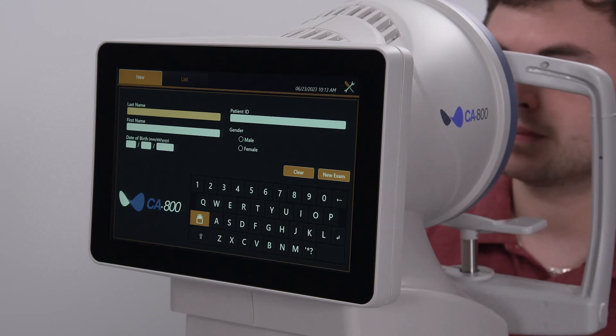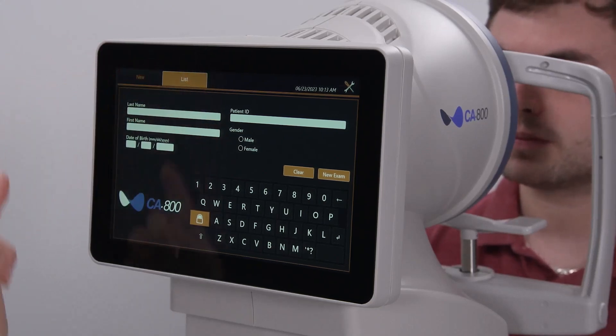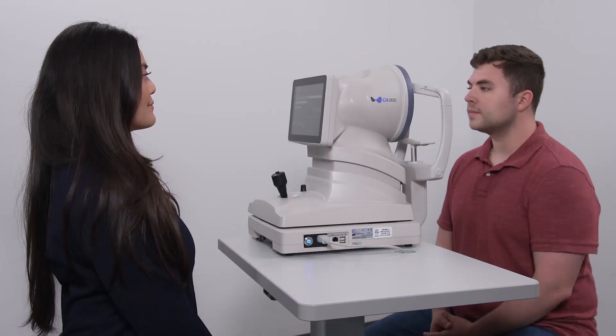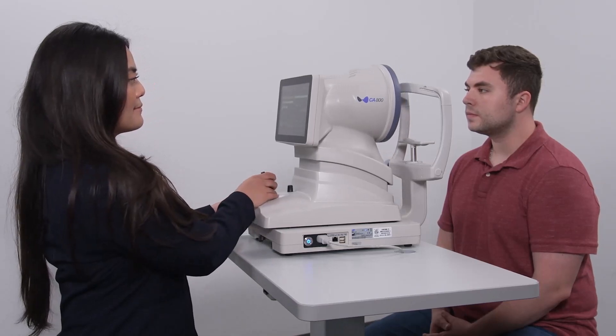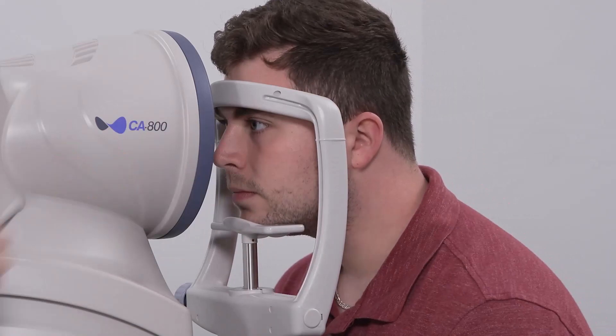After entering a new patient or selecting an existing patient and activating the scan acquisition, start with the CA800 pulled back towards the operator as far as the instrument will allow. Position the patient so they have their chin down and forward in the chin rest and their forehead forward against the forehead rest.